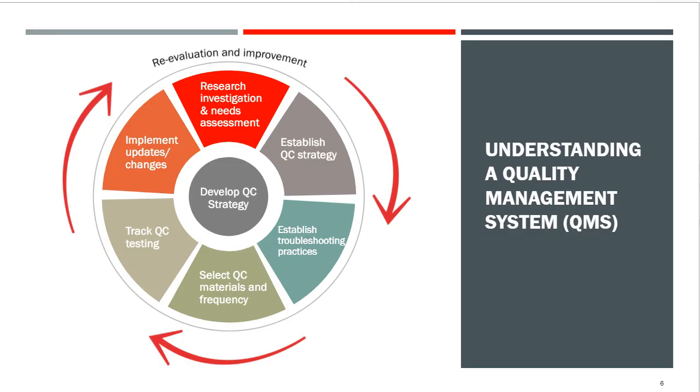To start, let's understand a quality management system, or QMS as we'll often refer to it. It starts with research, investigation, and needs assessment. You've got to know your own situation and what your needs are and what your customer needs are, your customers being the patients, the physicians, the other departments in the hospital perhaps.